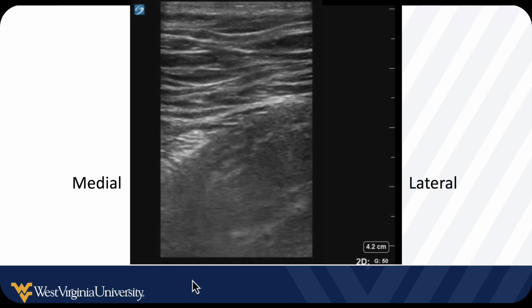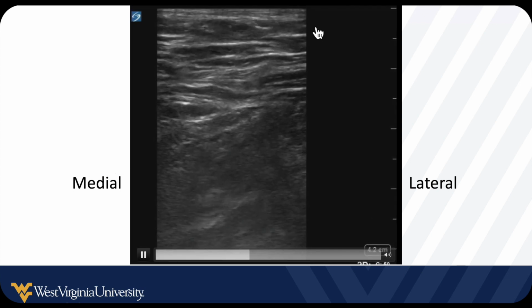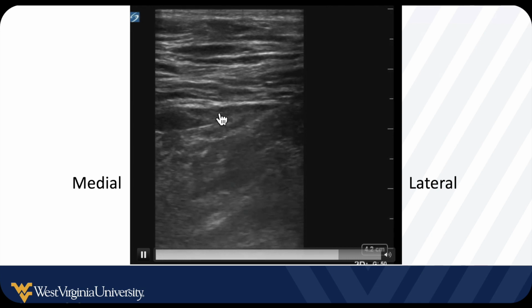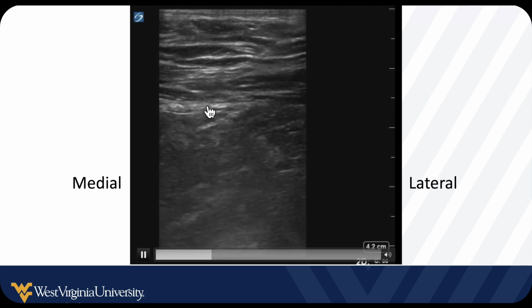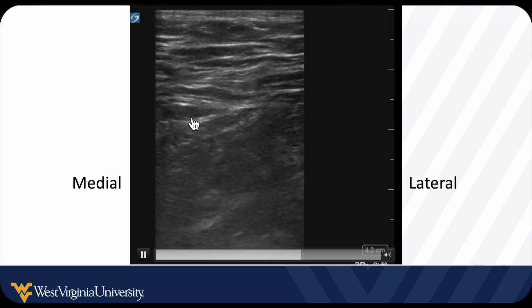And here's an example. In this case, we're going from medial to lateral. The femoral artery is over here. Our needle is coming right down through here, and you can see here's the local anesthetic being injected just under that fascia iliaca, peeling it off of that iliacus muscle. There's the needle, fascia. We want to get right underneath of it. There's the fascia. We're peeling it off of that muscle, and that's exactly how we do the injection.